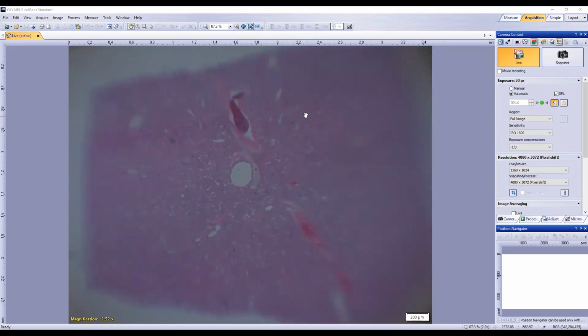Good stuff. So is there much more that we can get from this power? It seems the alveoli are maybe filled with some kind of effusion material, like eosinophilic amorphous material or something. I don't know if it was said before. Not specifically, no. So that's really good.